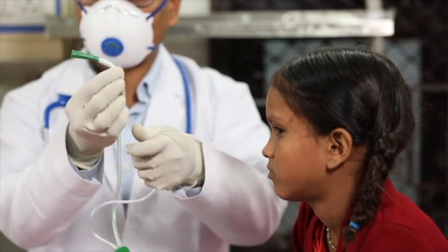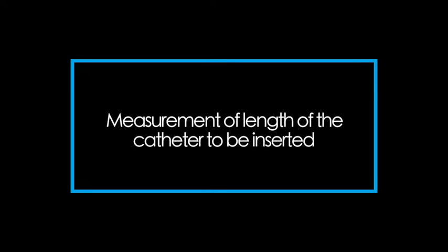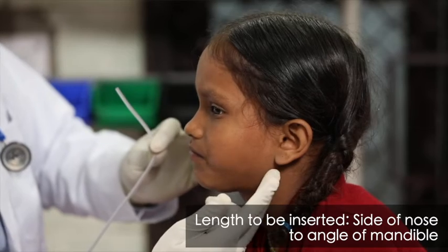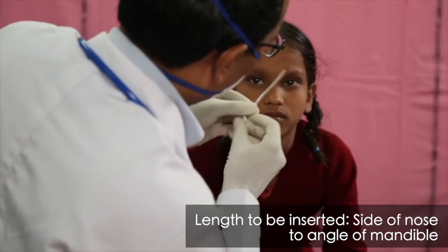The catheter is inserted through the nose. The length of the tube to be inserted is measured from side of the nose to the angle of the mandible.